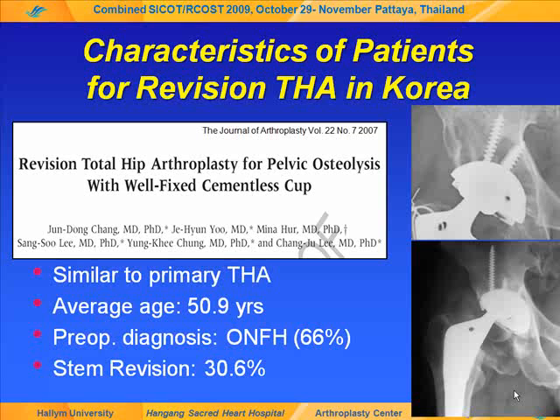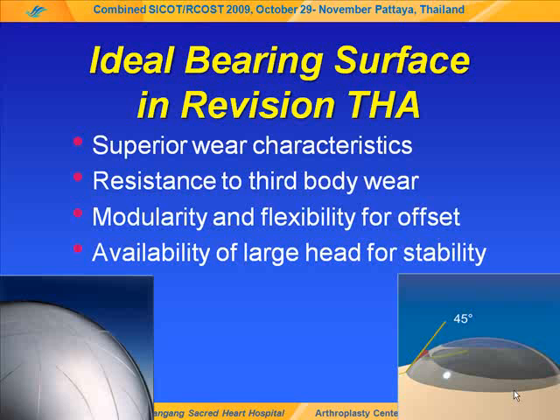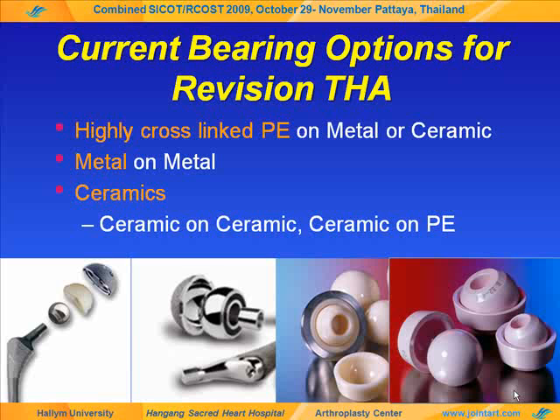Furthermore, we found that the characteristics of revision patients are similar to those of primary total arthroplasty in other studies regarding revision total arthroplasty. Then we can say the bearing surface is an issue in revision total arthroplasty. However, there are few studies mentioning bearing surface in revision total arthroplasty. The ideal bearing surface in revision total arthroplasty should be the same as in primary total arthroplasty. Currently available bearing surface options can be used for revision total arthroplasty.